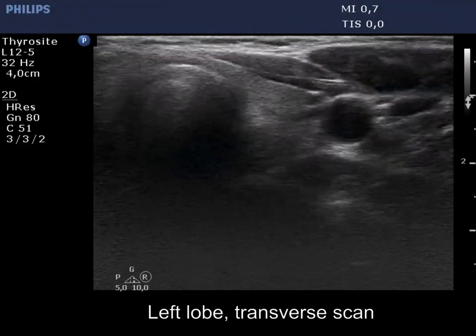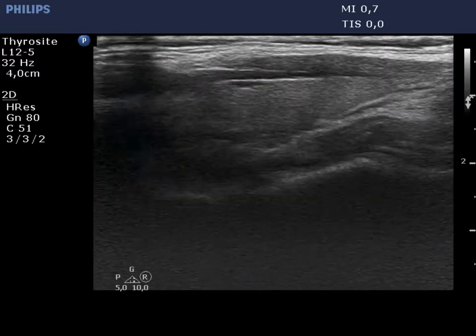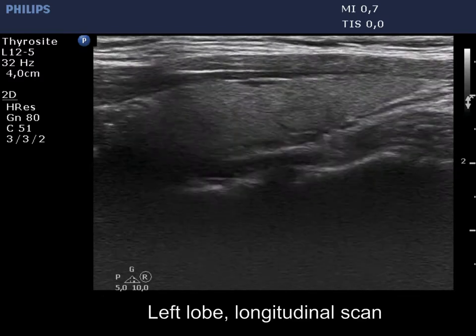The left lobe is intact, and the several discrete lesions cannot be regarded as pathological.